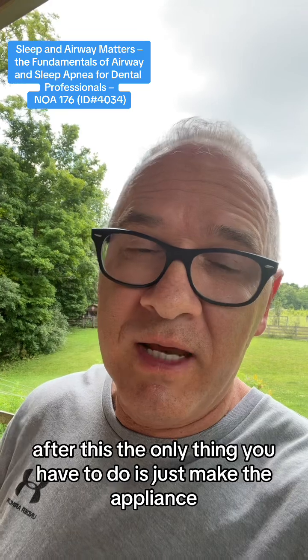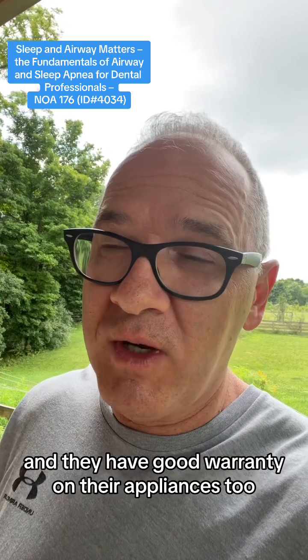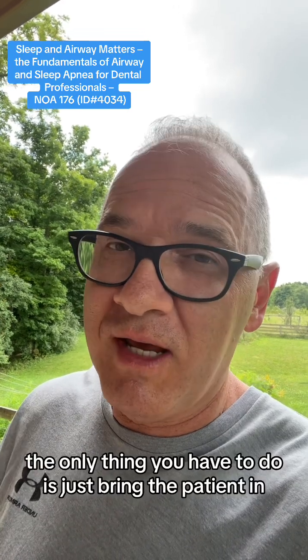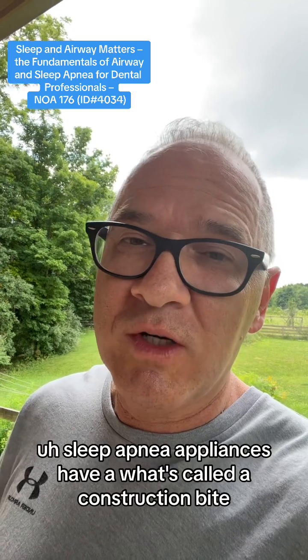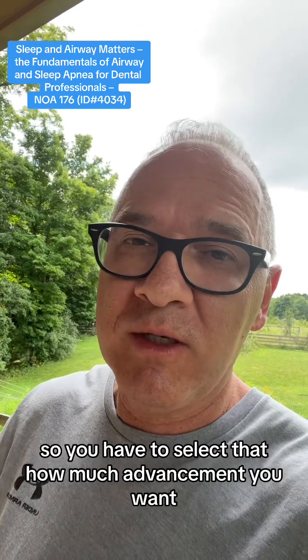After this, the only thing you have to do is make the appliance. You have to select what kind of appliance you want to use. I really like Somnodent because it's a great company and they have good warranty on their appliances too, and they're very sturdy and they hold up really well. And the only thing you have to do is bring the patient in and scan the arches and get a bite record. Sleep apnea appliances have what's called a construction bite, where you actually have to get a bite record where the patient's jaw is advanced. So you have to select how much advancement you want.